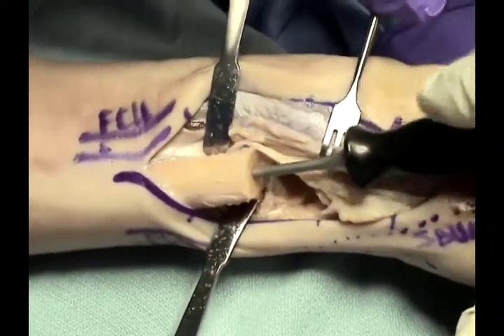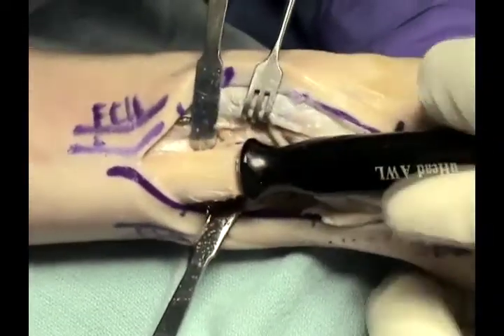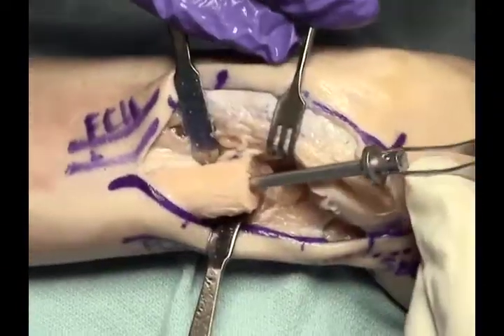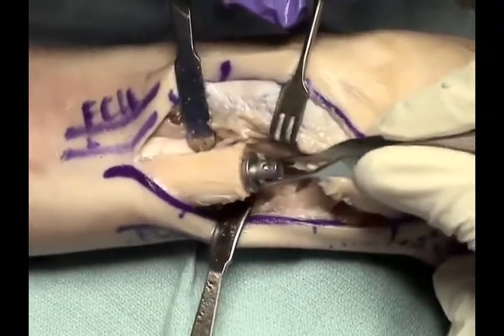Trocars and then broaches are used to prepare the canal for the ulnar stem component. Cannulated reamers can be used when the canal is difficult to locate, particularly in revision surgery.